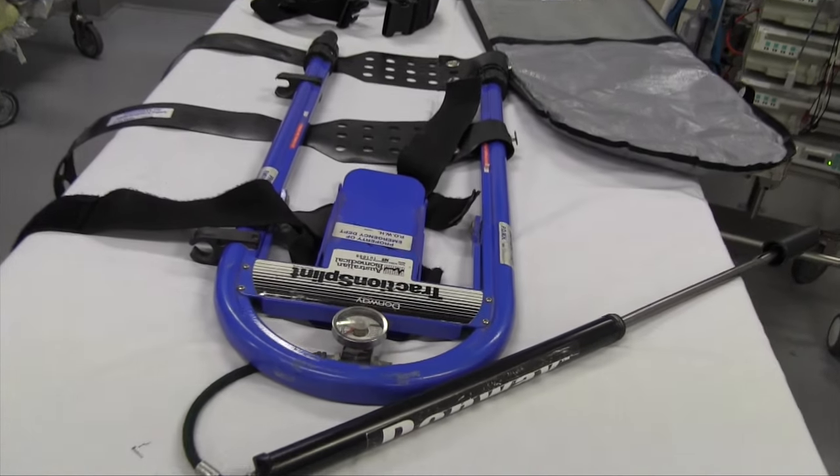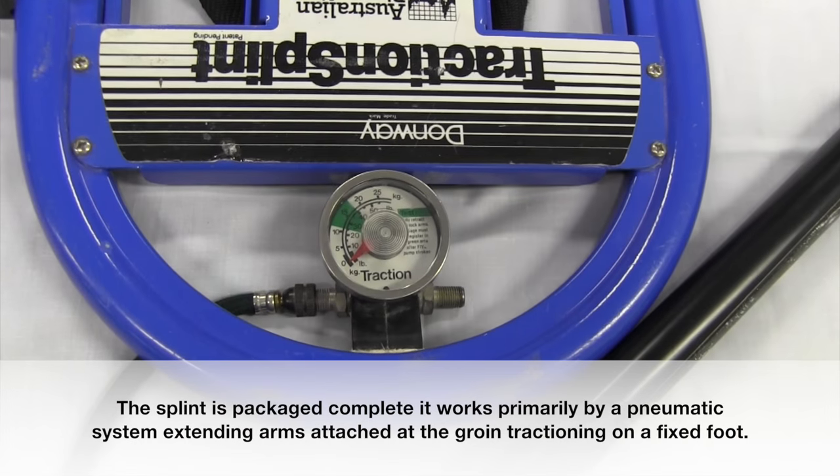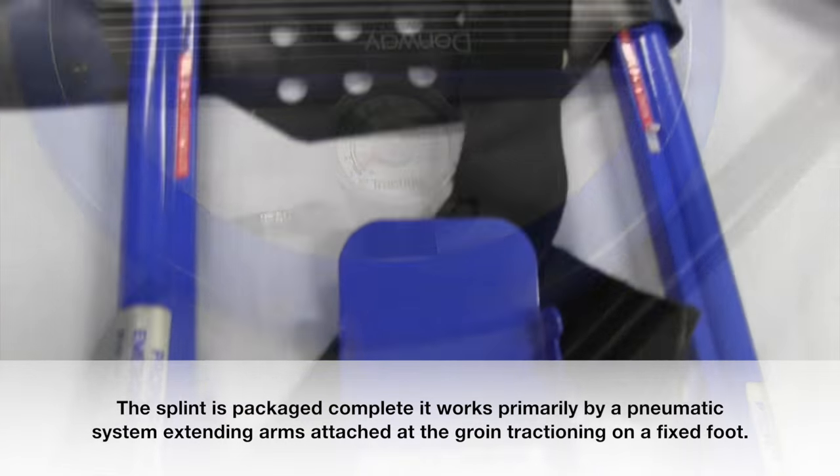The splint is packaged complete. It works primarily by a pneumatic system, with extending arms attached at the groin, tractioning on a fixed foot.